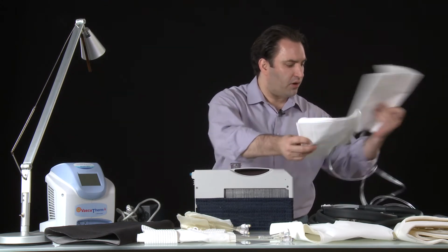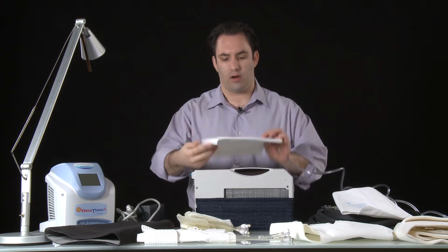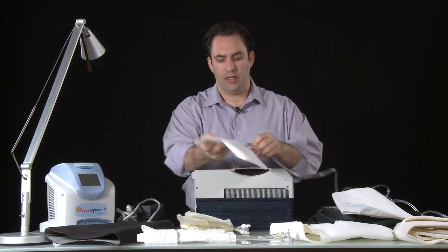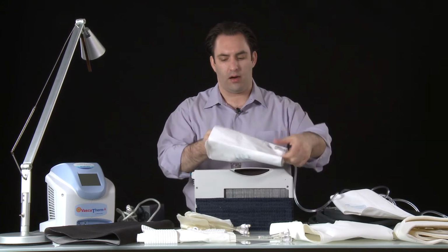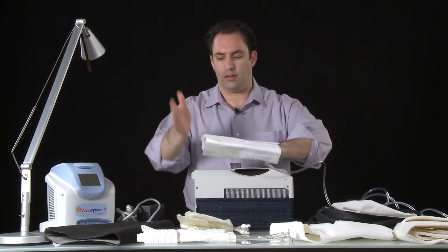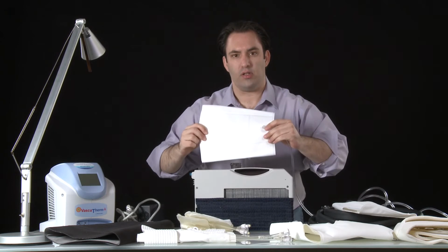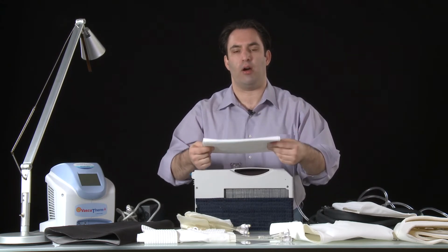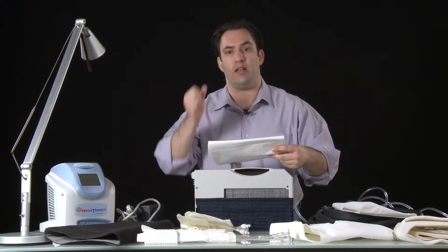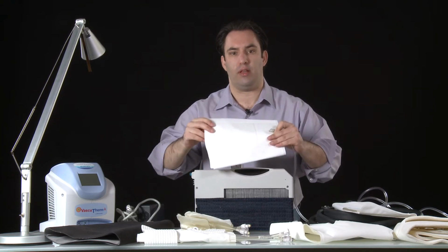If you're coming to us or you've gotten this product, you might have been given a set of these. These are pretty standard throughout the industry. It's a calf wrap. Imagine your foot is here, your leg is there, and the rest of your body's here. If this was my calf, it'd be like that, and then my hips would be up here. I've got 3 chambers, okay? And those chambers inflate sequentially, and that's going to push blood back to my heart by increasing venous velocity or venous return by a rapid inflation of pressure within these chambers.